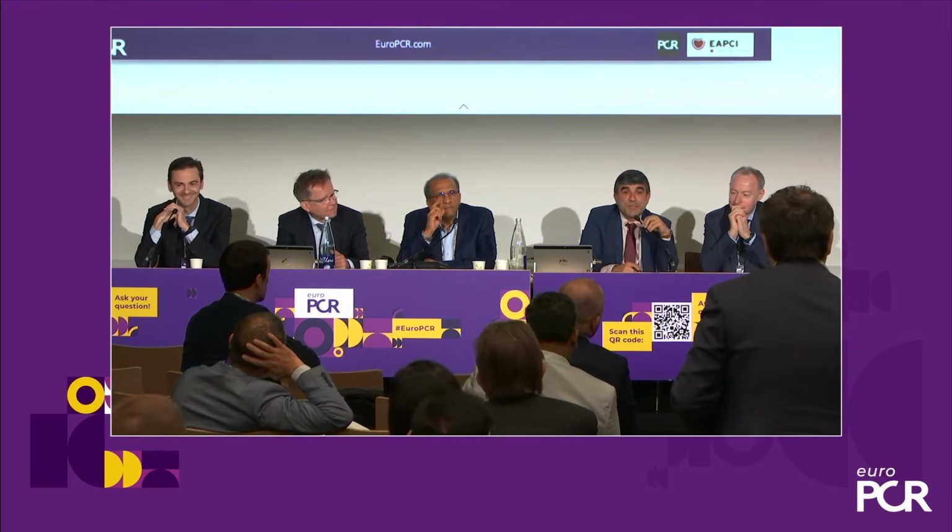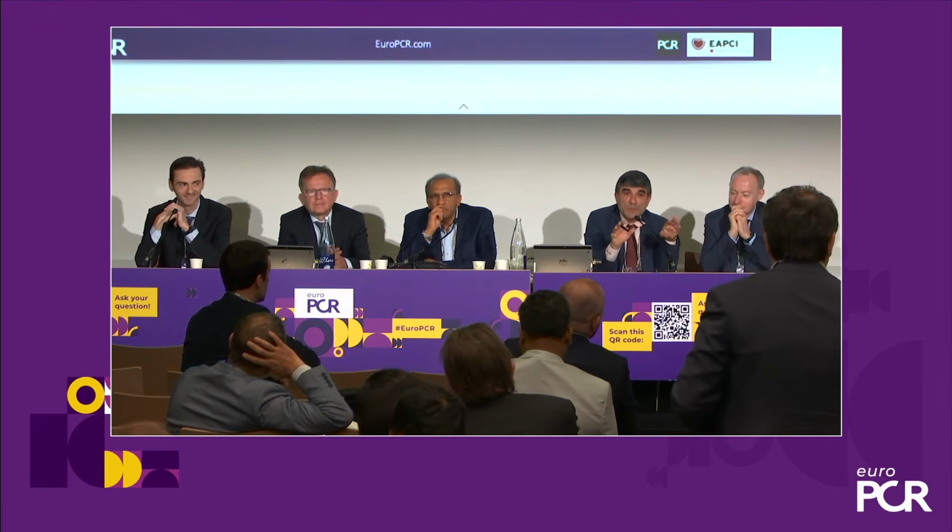Yes, I have done it. It's off-label. You have to be really experienced with this. I've done it with CTOs very frequently, where I cannot cross the proximal cap, and I have used laser with the wire not there. But you have to be really safe to make sure where you are, and you activate the laser in that area. I'm not advocating this for people just to go and do it that way. Absolutely not. When you get the experience with it, you might be able to do it, but yes, it can be used. And I know that some operators in the USA have started doing the same. So it does work that way.